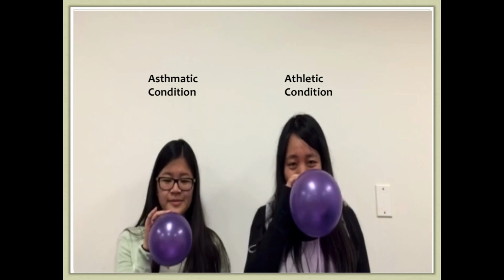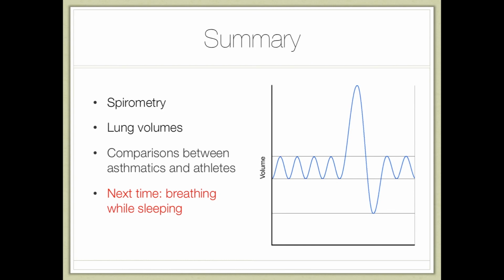In summary, we introduced spirometry and saw how it can measure lung volume, and we compared that the person with asthma has much less exhalation than an athlete. Next time, we'll talk about breathing while sleeping.